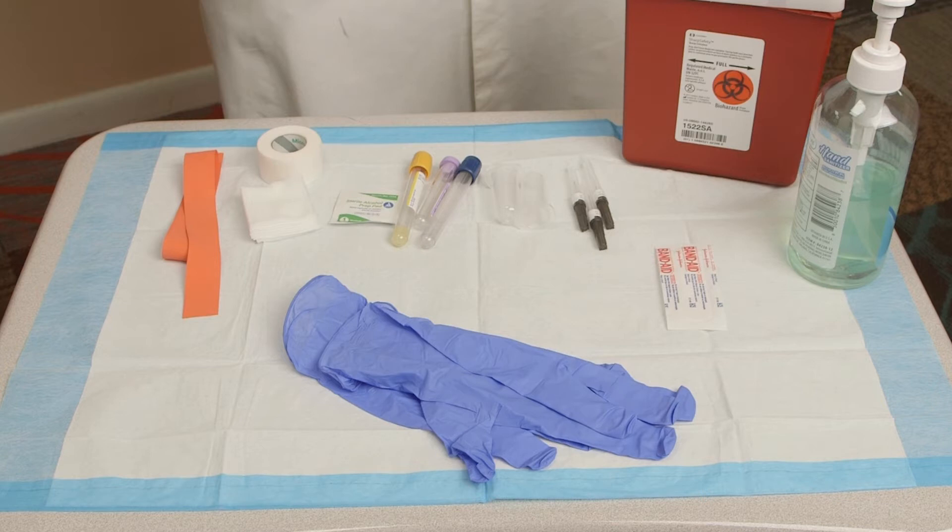Here is the list of supplies: tourniquet, cotton or gauze tape, 70% isopropyl alcohol wipes, a vacutainer with tubes for testing, multi-sample straight needles — usually 21, 22, or 23 gauge — tube holders or adapters with safety guard, needles with safety guard, biohazard sharps container, your lab order, specimen transport bag, hand sanitizer and disinfectant wipes, and personal protective equipment including well-fitted non-sterile non-latex gloves, face mask, face shield, and a coat or gown with full-length sleeves, fully buttoned.